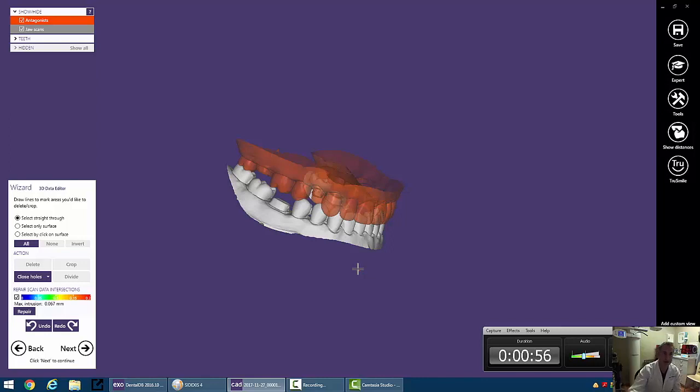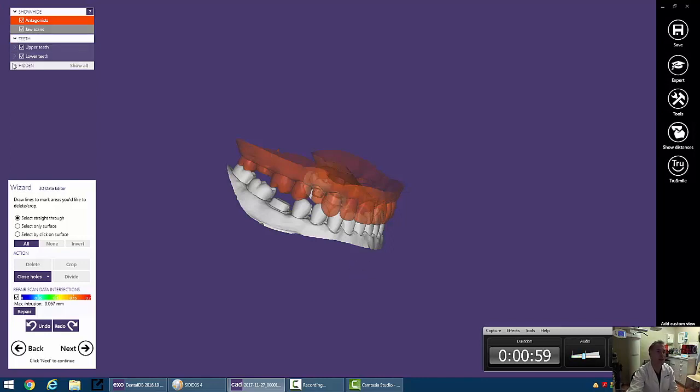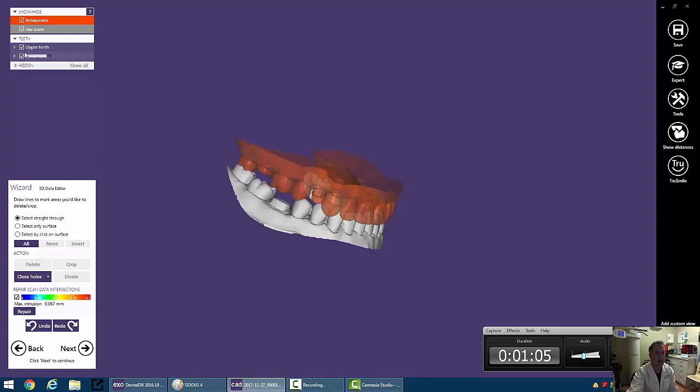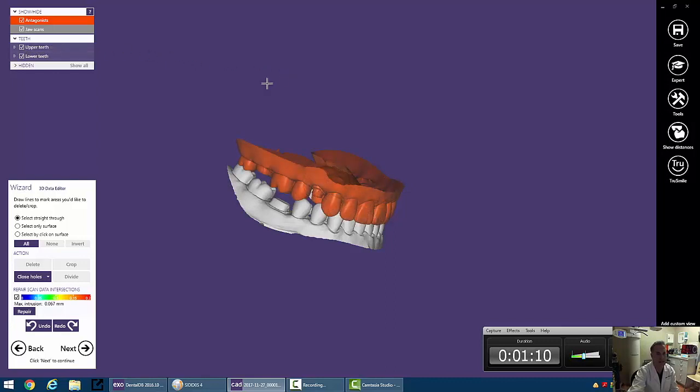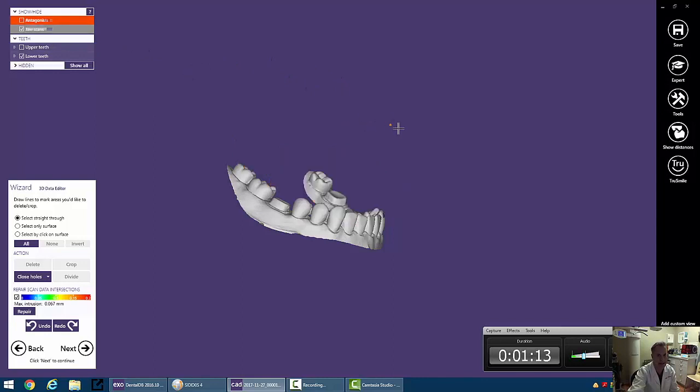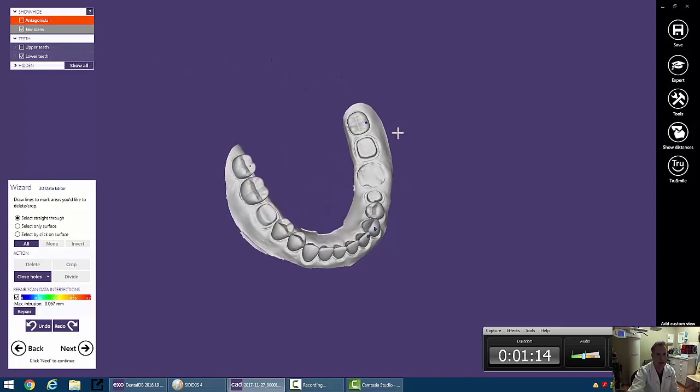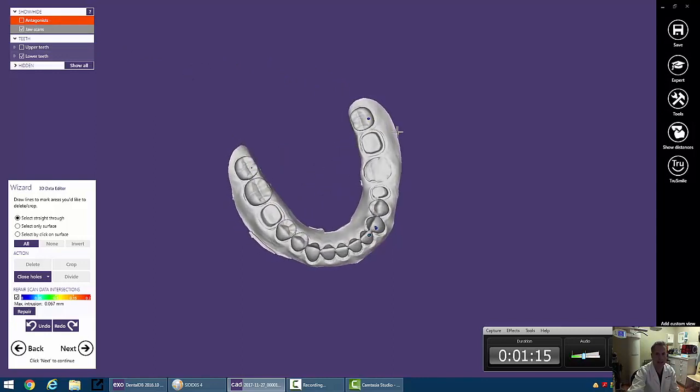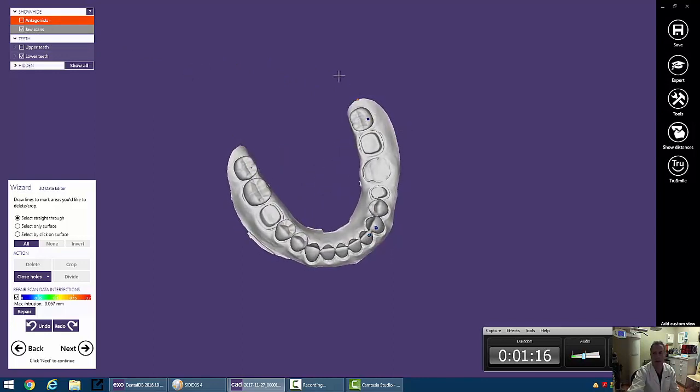So over here on the left, we have little boxes that allow us to turn off and on models. So we can turn these off and on. We can also make things transparent or opaque if we wanted to. But for the sake of this, let's go ahead and turn off our antagonist, or our upper model, and take a look here.